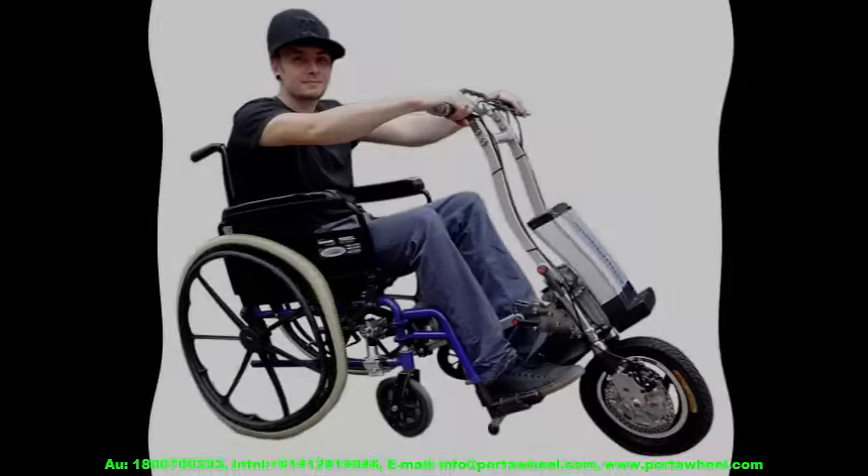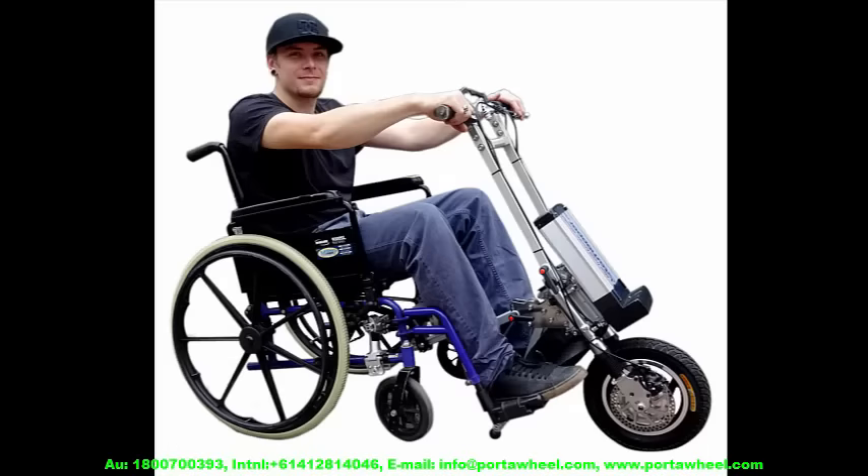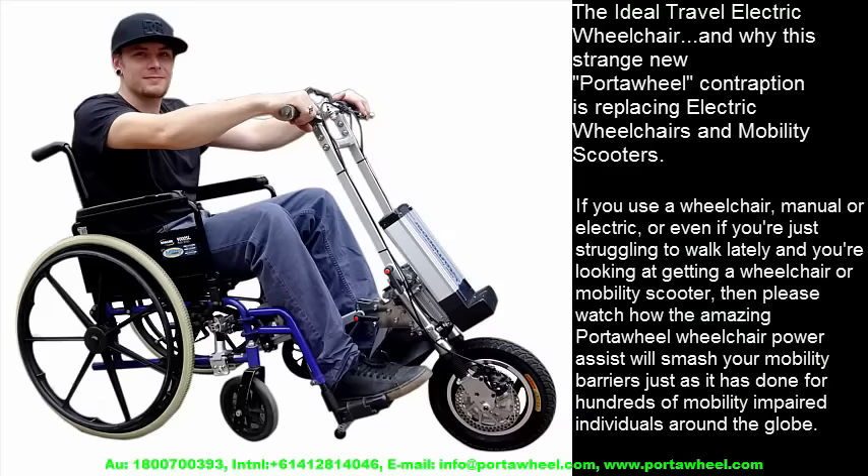Hi, it's Hilton here from PortaWheel. I hope that disruptive beginning got your attention, because what I want to tell you about could be life-changing for you. The ideal travel electric wheelchair — and why the strange new PortaWheel contraption is replacing electric wheelchairs and mobility scooters.